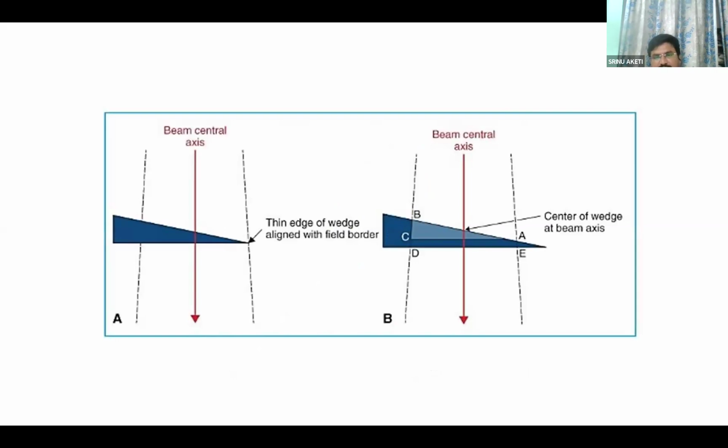Any idea about different types of wedges or anything you want to say? Sir, here. Any idea about different types of wedges? Yes, sir. Physical wedges.